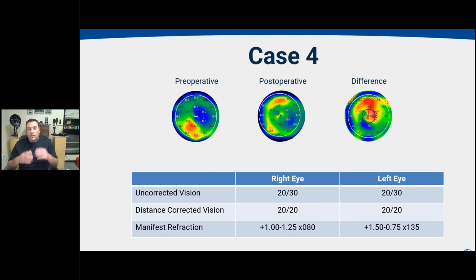So the key point here is what the AXL wave allowed us to do by taking such detailed measurements of the anterior segment is look at a complex case of irregular cornea and first pause and say, this is definitely different than a routine case, and then try to drill down and see where the refractive problem is coming from, in this case, the cornea, and then address that corneal problem and really avoid doing cataract surgery, at least for now, for this patient entirely.